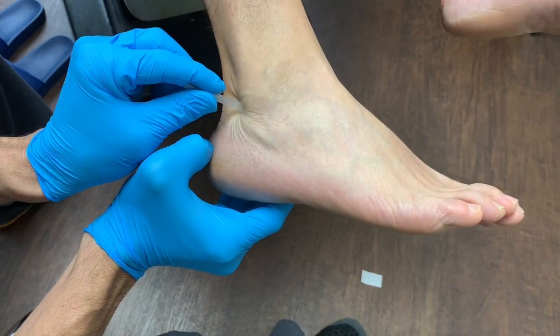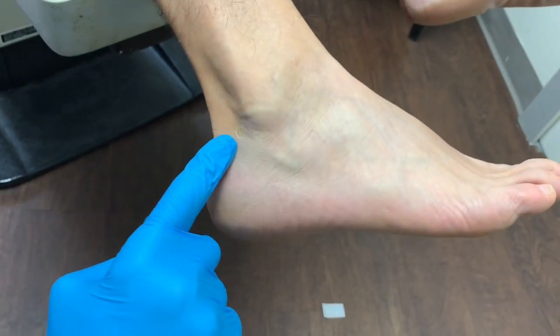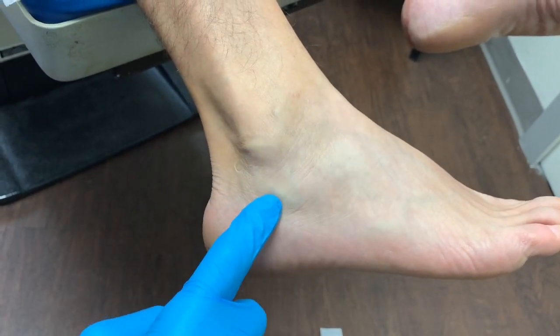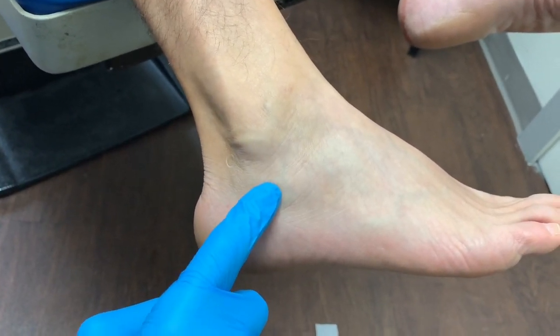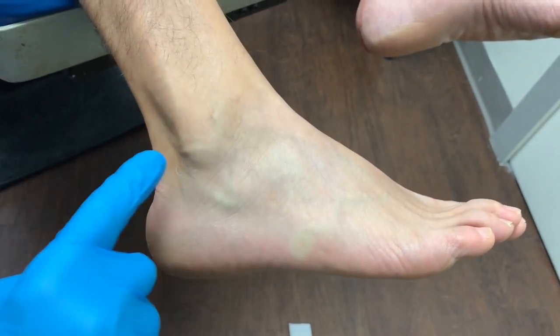We'll mark it. Look at the difference in swelling for everyone — there's no swelling here on this side. What's nice is that this is the tendon we peppered on the other side, and it inserts right here. So we'll go ahead with this.